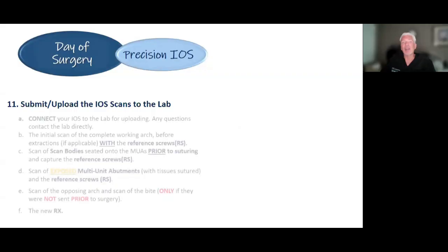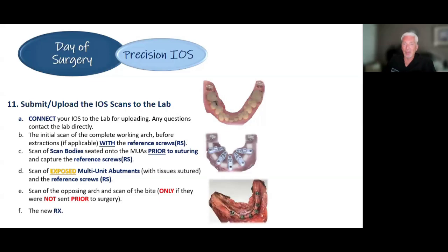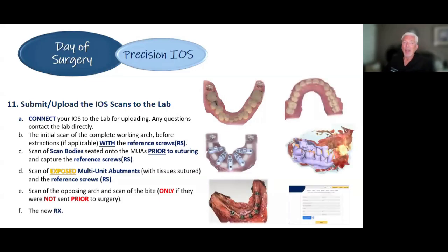So now the next step is to upload this data to your laboratory. These are all the scans that you took that you're going to be uploading to the laboratory. Again, this is day of surgery. You see that you've connected to the laboratory. You're going to upload the pre-op model with these reference screws in.